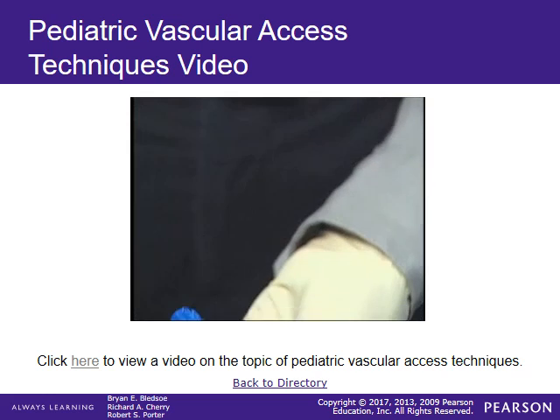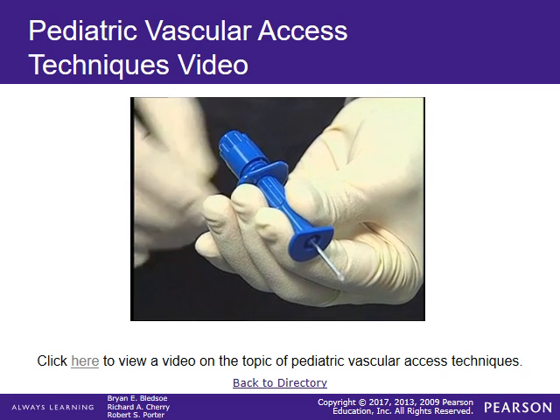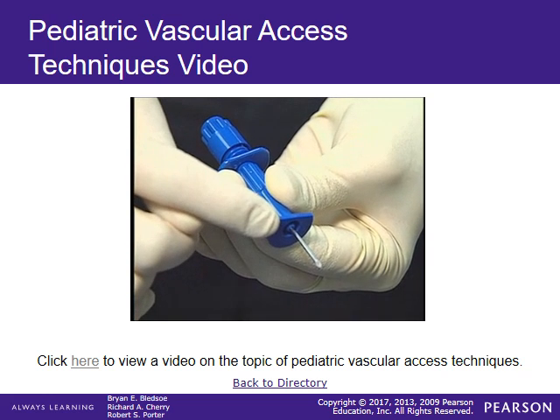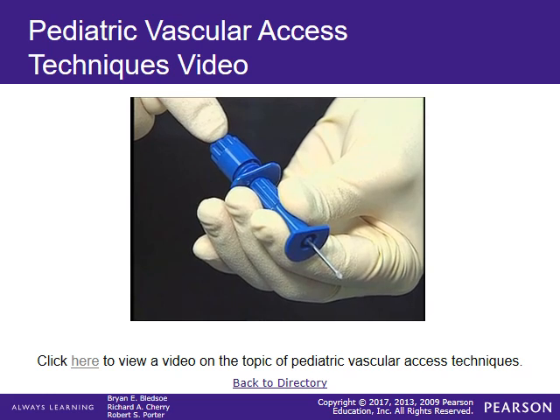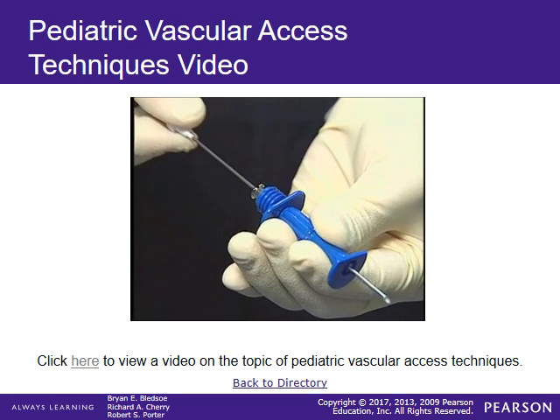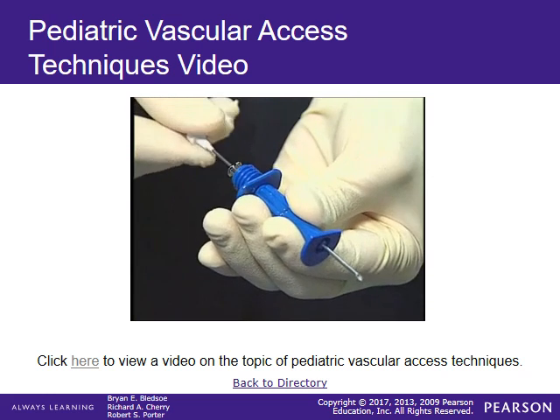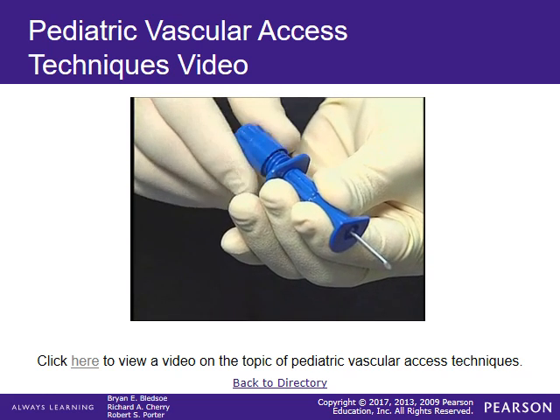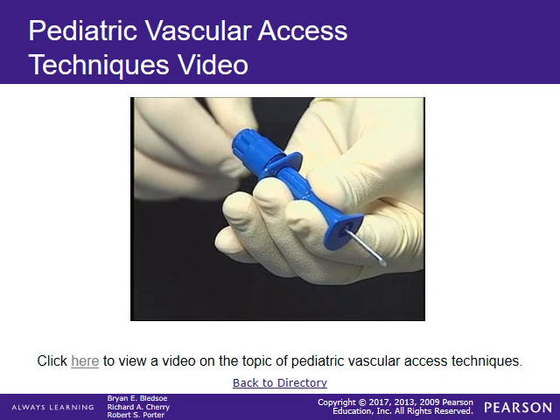In order to inspect the intraosseous needle, you first must know its parts. The external pieces are the needle itself, a flange that prevents you from inserting it too far, and a cap, which covers the stylet. In order to check the needle, take the cap off and remove the stylet. Make sure that it comes out easily and that it can be reinserted easily. Once reinserted, attach the cap again. In some cases, you may want to screw down the flange to prevent insertion of the needle too far.